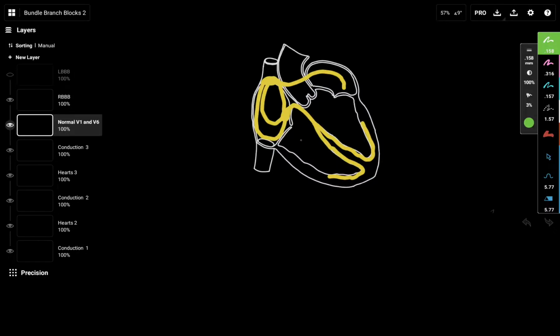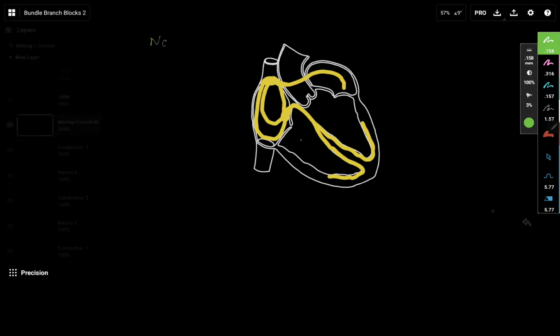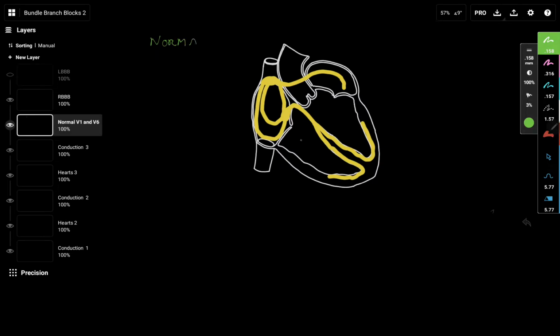Hello everyone, in this video we're going to go through the bundle branch blocks. To begin with, we're just going to recap what the normal conduction through my heart is. So these will be my normal views.